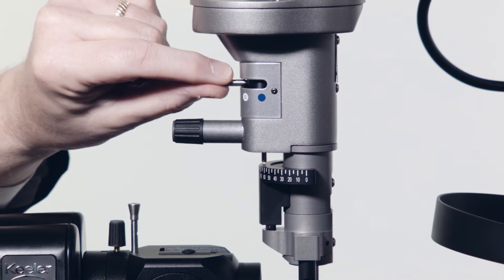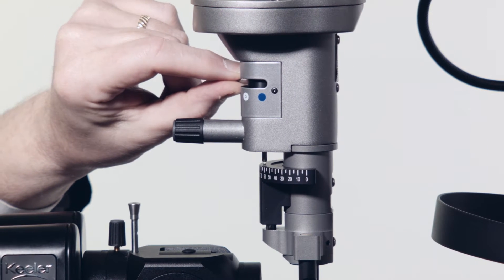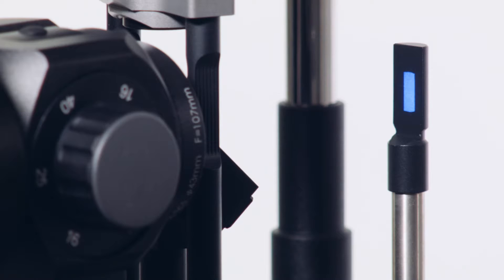The K-Series slit lamp offers a full range of filters required for examination. These filters are blue, neutral density diffuser, red free and clear.